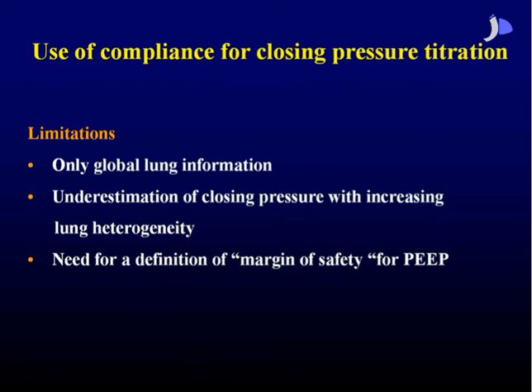Another question is whether it's completely necessary: if you can have a complete recruitment in a supine position, you could just turn the patient prone and see if you can reduce pressure 2 or 3 centimeters of water. So these are two different things. I think there's a synergistic effect, but I think that in a supine position you can achieve the goals if you have a rational strategy.